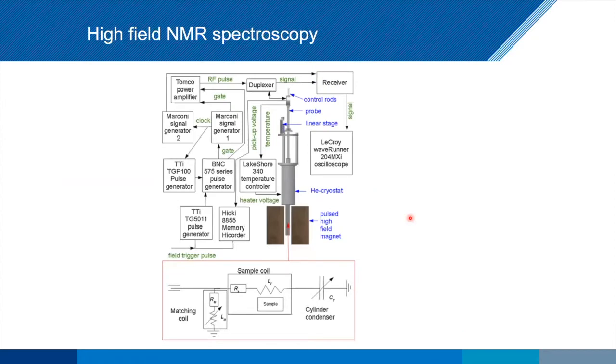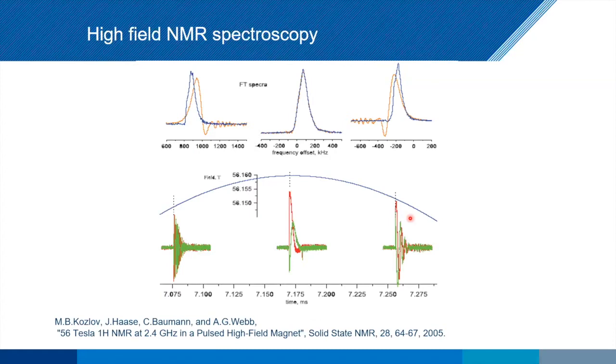So obviously, you build absolutely everything yourself for this system. And then these are the results that we got out. And again, some of you will know Mikhail Kozlov over here, who was the person who really designed a lot of this electronics. But you can see here that as the field is going from 0 up here, we managed to catch it exactly where it needs to be with the coil. So we're catching this at 56 Tesla. Our coil is low Q, so we can actually catch it a little higher over here.